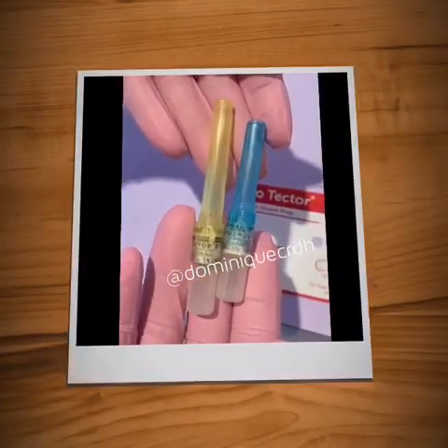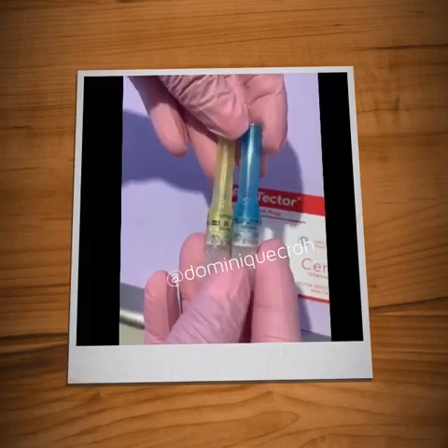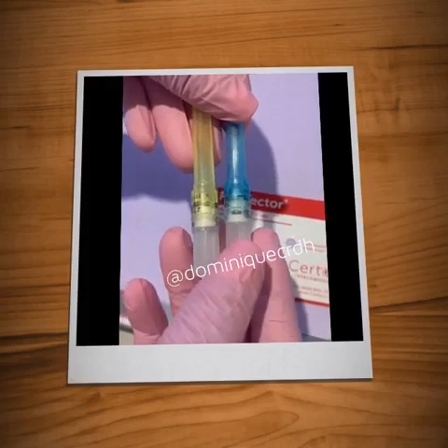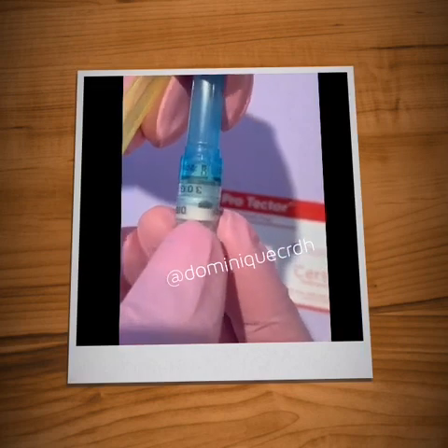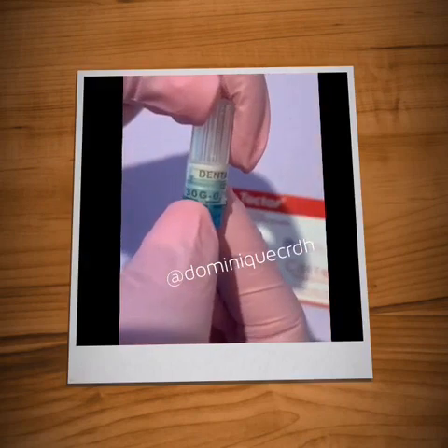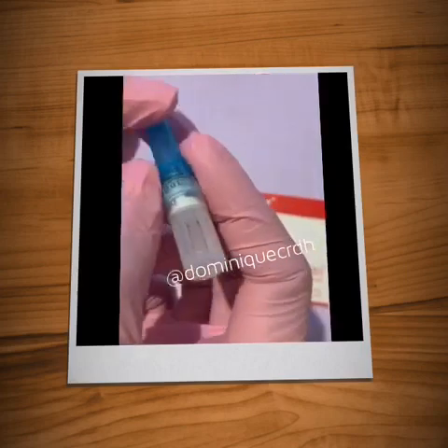Next step is needle inspection, and here is a long and short needle. Typically at our office, we are all happy with using a 30 gauge needle, and I'm just going to show you the area where you can find the size of the diameter of the needle, and that is located right on the side. As you can see here, this one is a 30 gauge needle. On the other side is the arrow that indicates the location of the bevel.